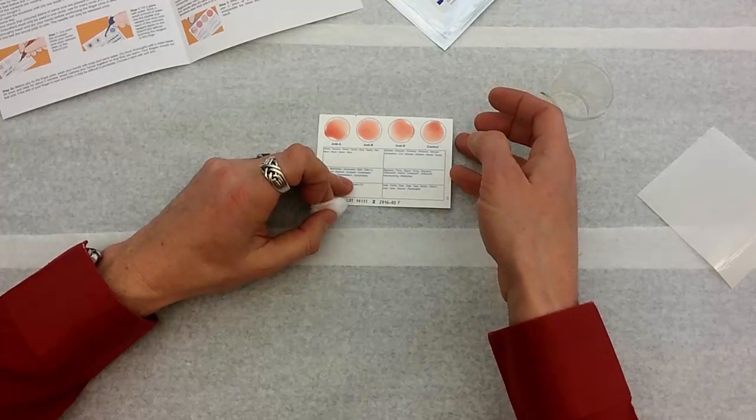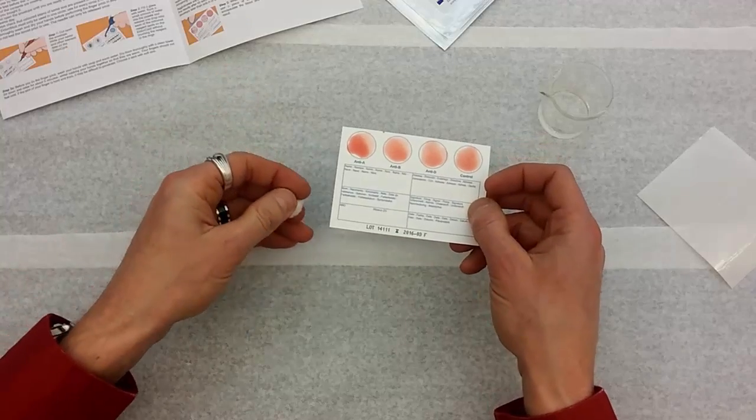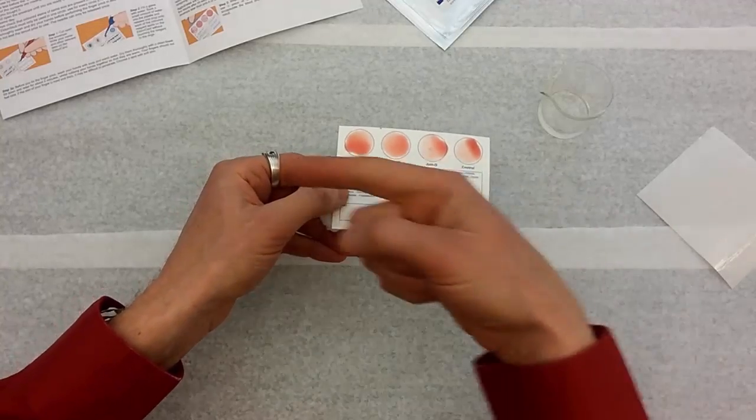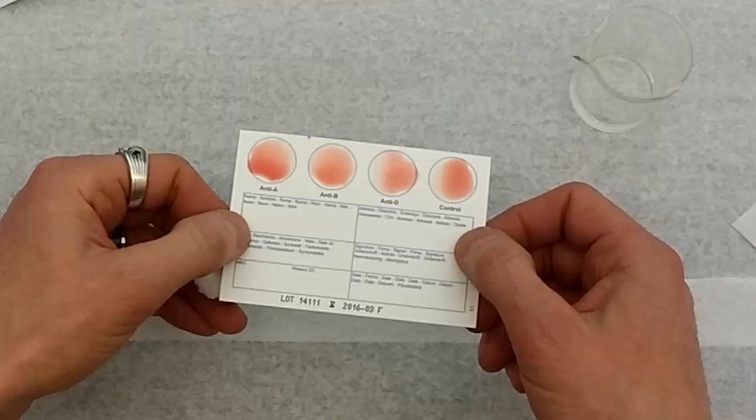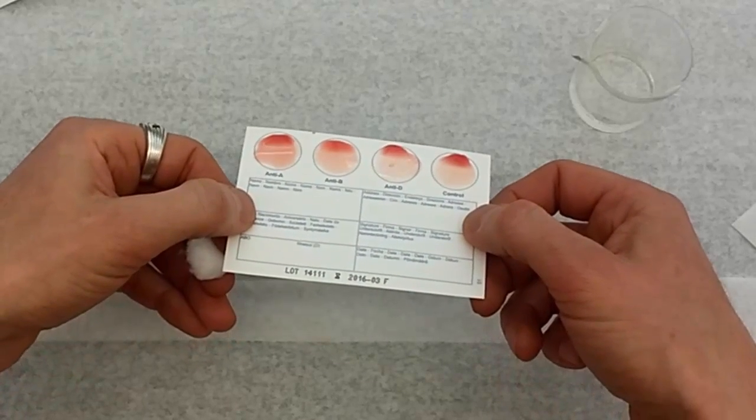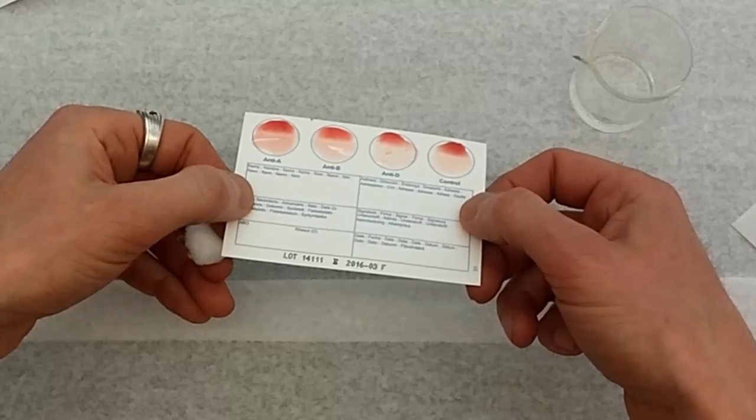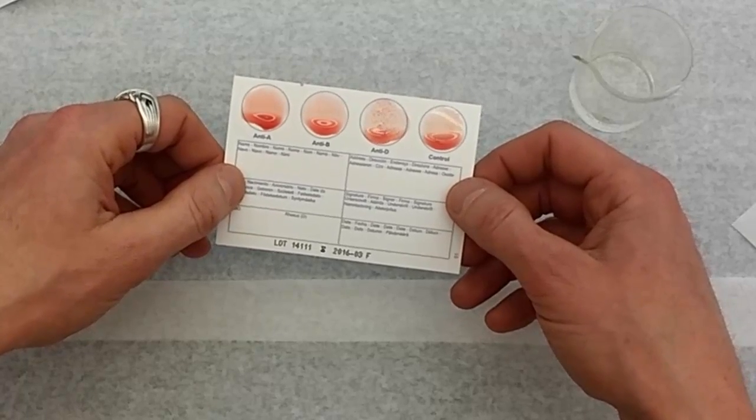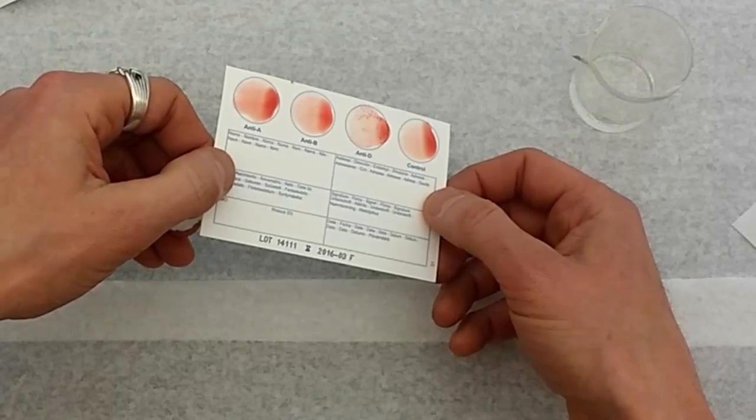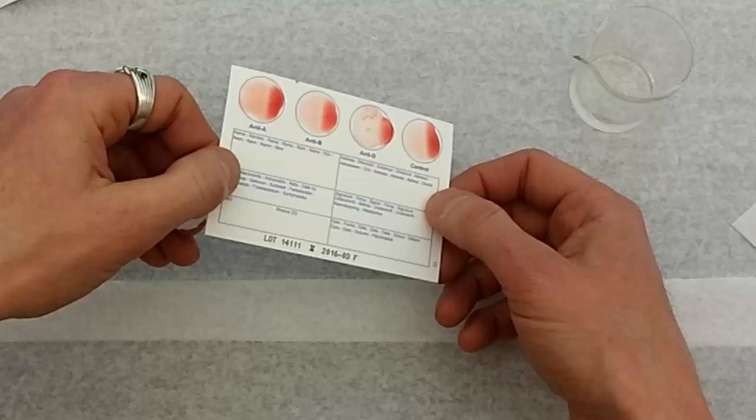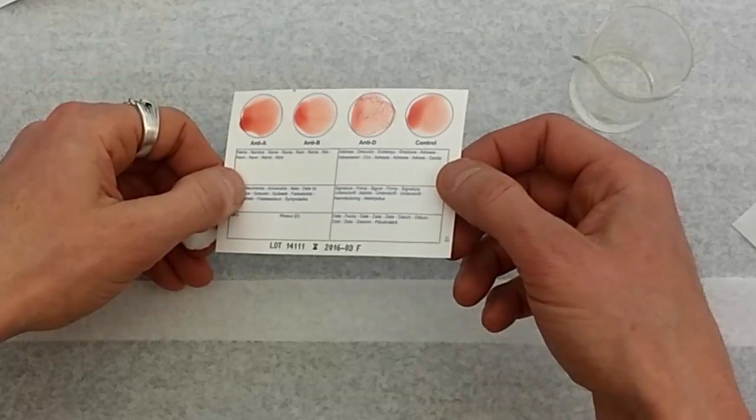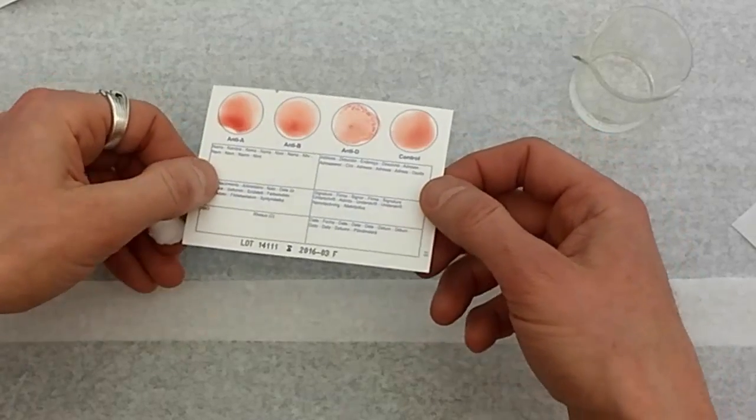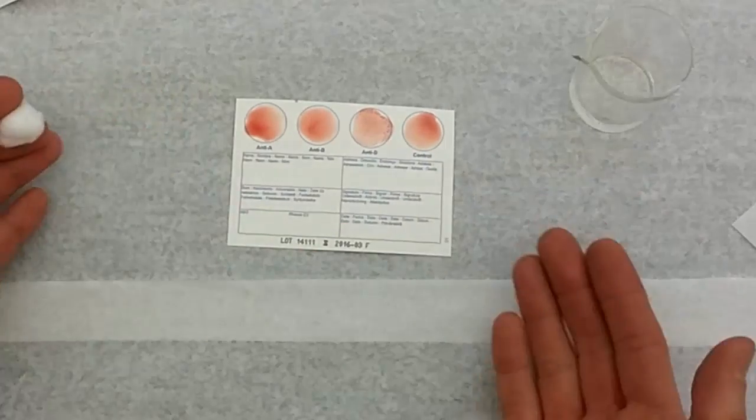Now we need to pick up the card carefully. And you may notice that one of my circles is already starting to react. The next thing to do is we're going to tilt the card slightly in the four directions. And we're going to hold them tilted for 10 seconds in each direction. And now I'm going to make sure the liquid is pretty even. And we're done.